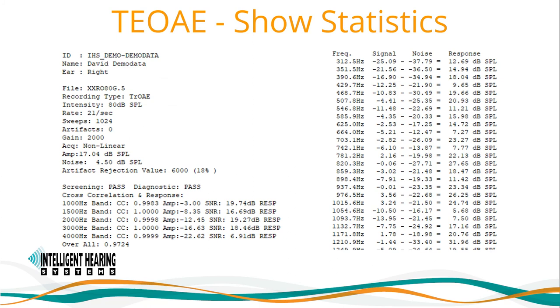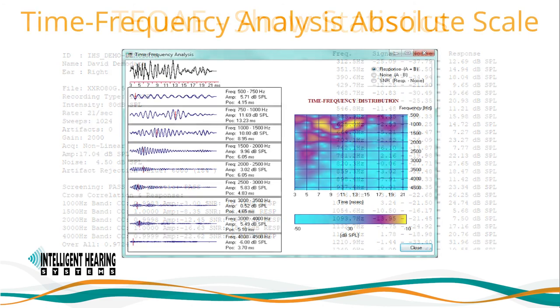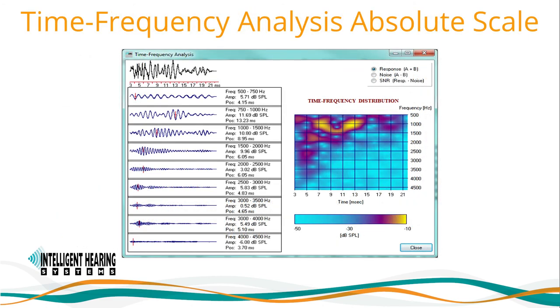All of the main information is displayed right on the display screen, but if you wish to see more frequency-specific bin-by-bin information, you can display the show statistics option. The Smart TEOAE software also provides graphical representation of the time frequency analysis and distributions for response, noise, and signal-to-noise ratio.